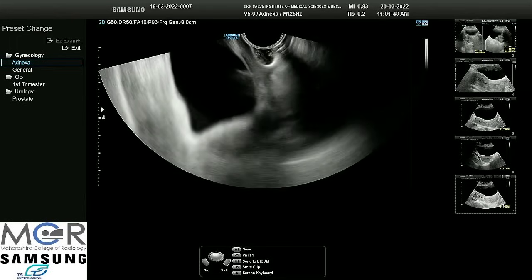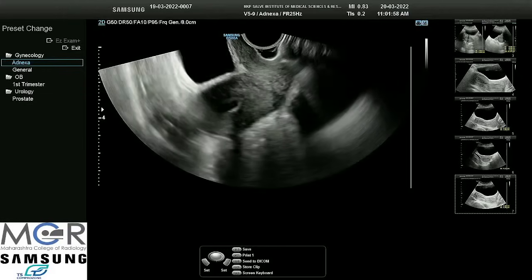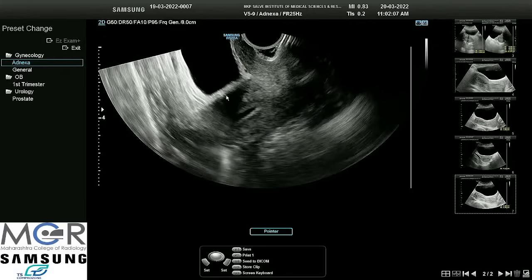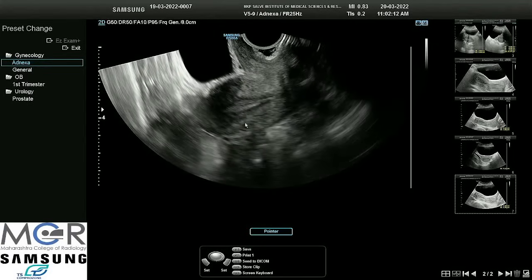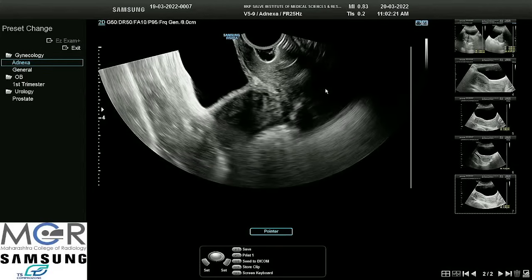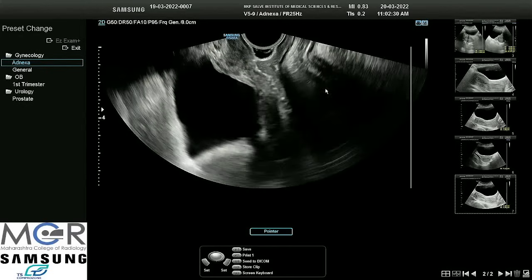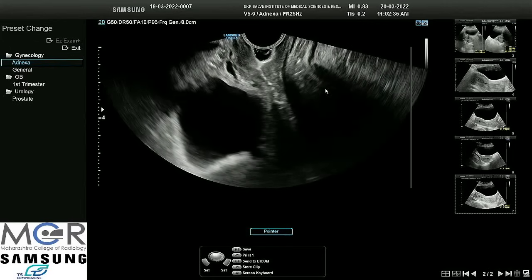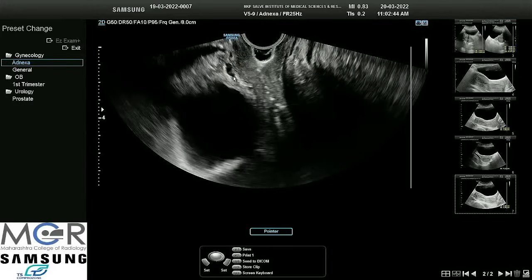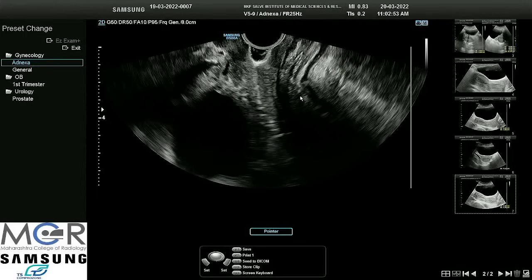This probe is connected. This lady had drunk a lot of water, so we are seeing that the bladder is filling up again — but in a way it is good because it gives us a reference point of the anterior myometrium. This is the anterior myometrium adjacent to the bladder, this is the endometrium, this is the posterior myometrium, and this is obviously the bowel. Before we start, we should always start at the introitus — as we introduce the probe we can see the bladder, the anechoic area here is the urethra, this is the vagina, and this is the anal canal. This portion should always be seen when we start the examination.